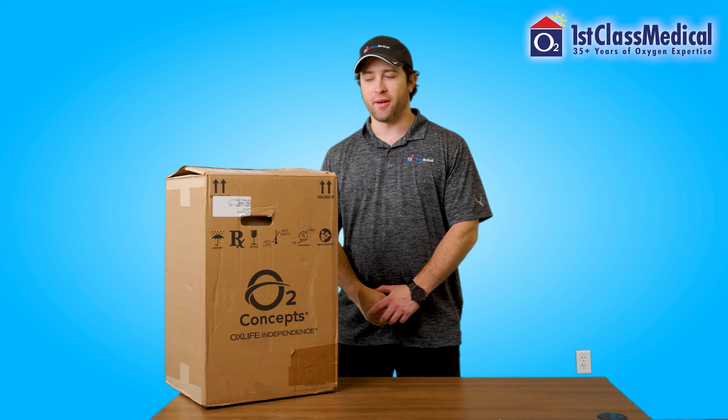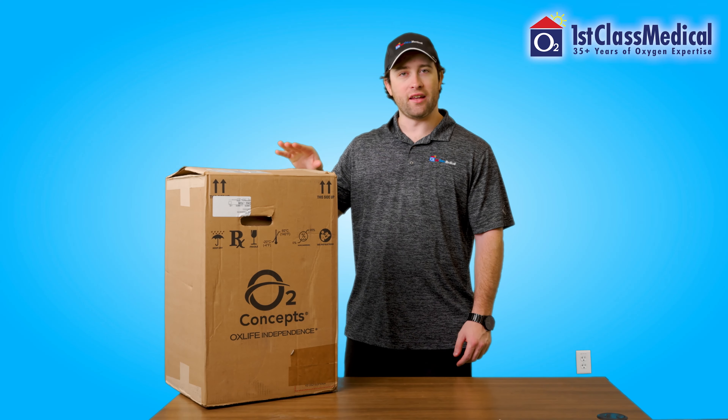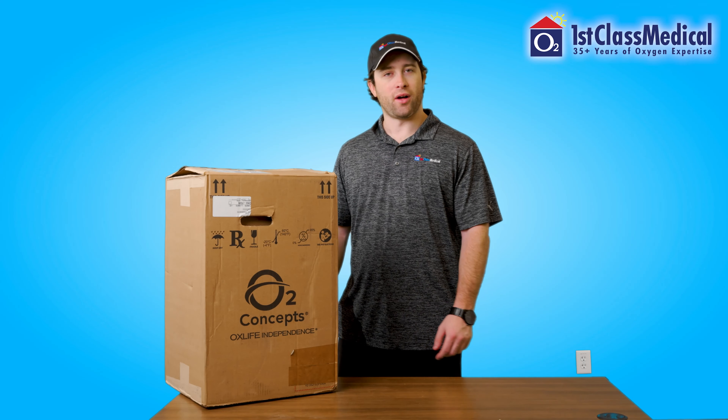Hi there, my name is Cory Luckner of First Class Medical, and in today's video we're going to go over the unboxing of the OxLife Independence Portable Oxygen Concentrator.